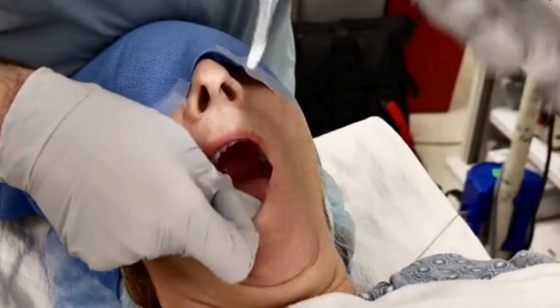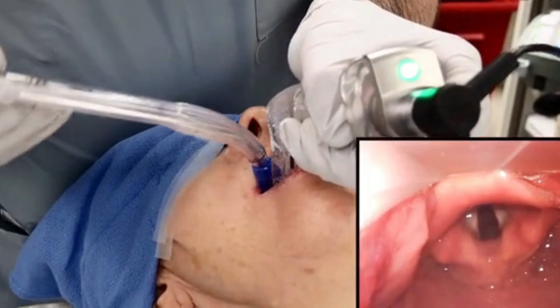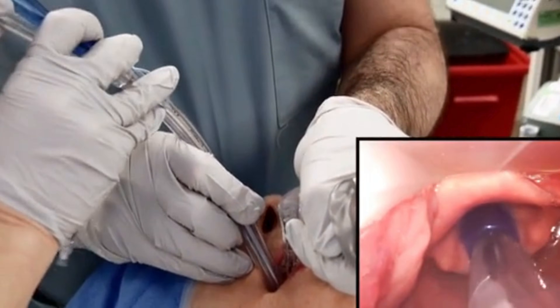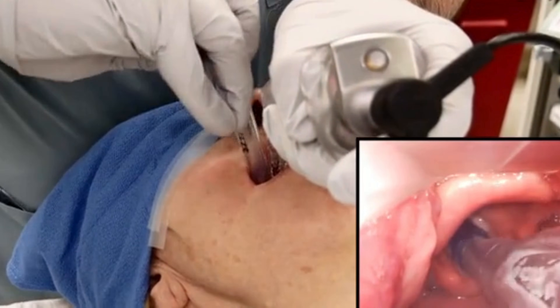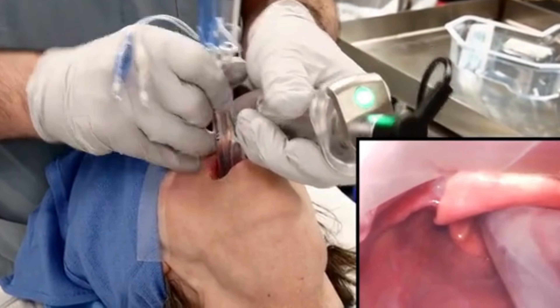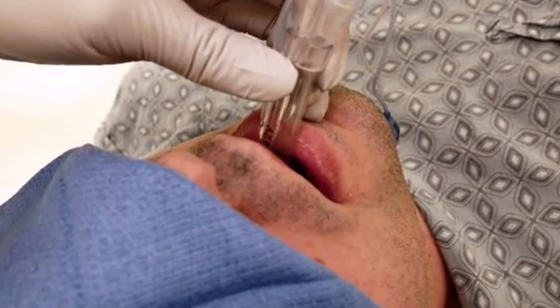Perform direct laryngoscopy to visualize the glottis. Advance the double-lumen endotracheal tube until the bronchial cuff passes the vocal cords, taking care to avoid touching the tube to the patient's teeth, which could damage the tracheal cuff. Remove the stylet. Rotate the tube 90 degrees to the left or counterclockwise for placement of a left-sided tube, and 90 degrees to the right or clockwise for placement of a right-sided tube. Guide the tracheal cuff past the glottis, typically advancing the tube to 27 centimeters from the incisors in women and 29 centimeters from the incisors in men. Do not advance against resistance.